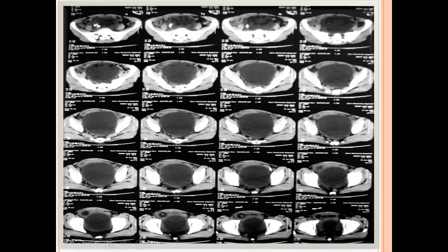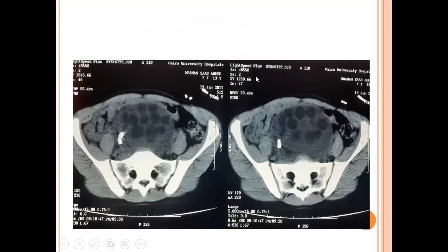Here is the uterus of this young girl — it is still a small uterus. This adnexal cystic lesion shows bone-like hypodense fat-attenuating structures, and there is also calcification seen here. These are fat balls floating within the cystic lesion, and this is a large bulky calcification seen in the cyst wall.